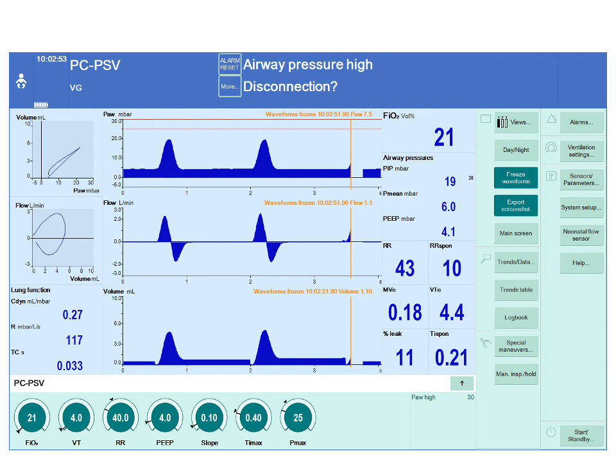So this MVE here, which you can see, and that's 0.18, for example. This is the result of multiplying your tidal volume and your respiratory or ventilator rate, basically. For example, this is here, that's the 40. Down there, that's the respiratory rate. This is what you set through the ventilator, and you can see up there in blue 43.